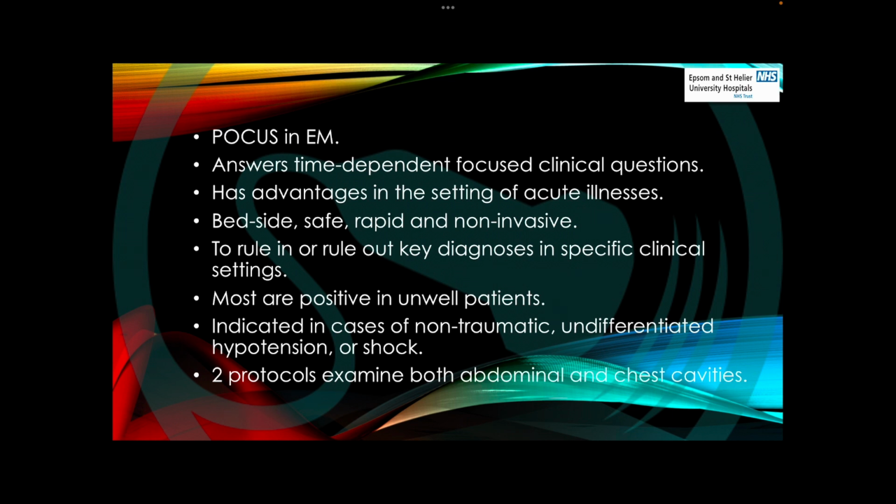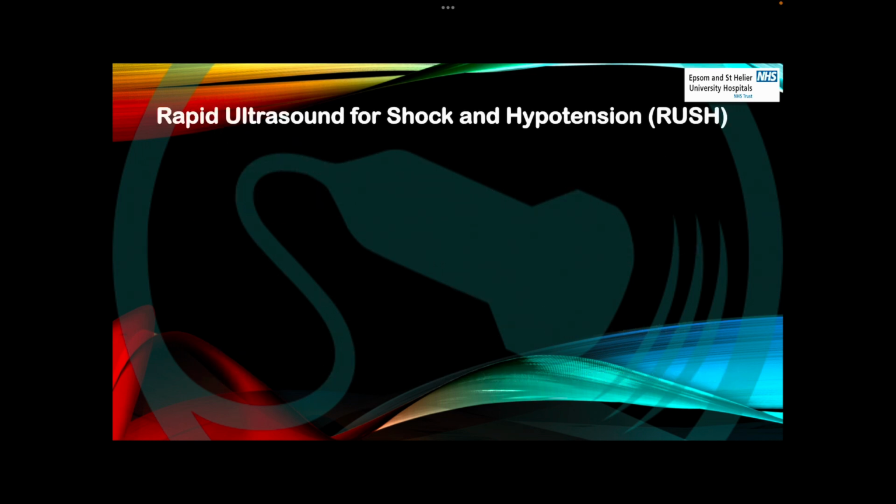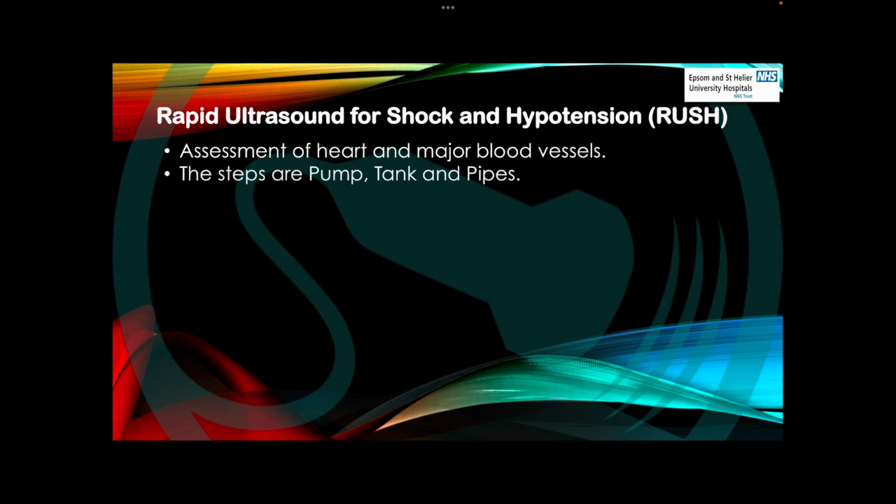Okay. So let's talk first about the rapid ultrasound for shock and hypotension, which is RUSH. So RUSH is a POCUS examination protocol that focuses on assessment of the heart and major vessels, and is divided into 3 steps: pump, tank, and pipes.